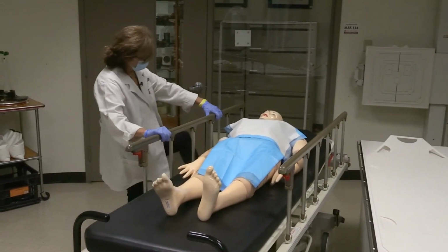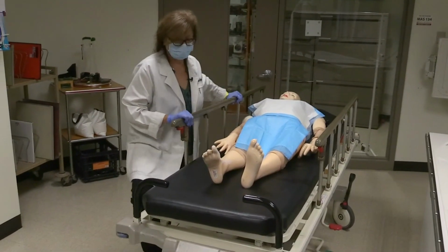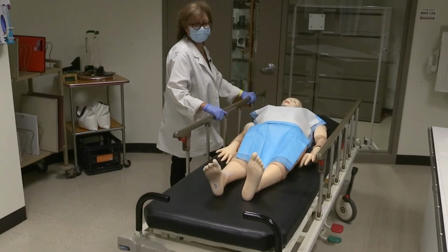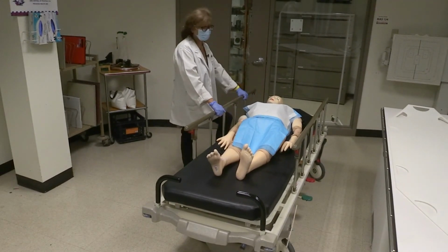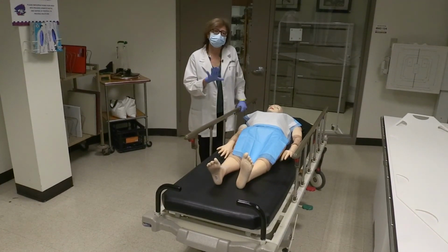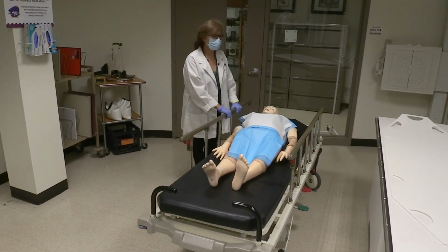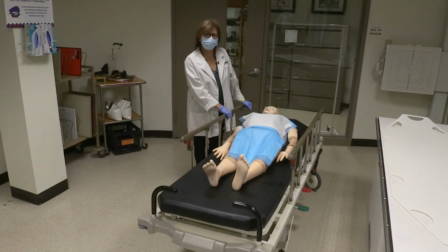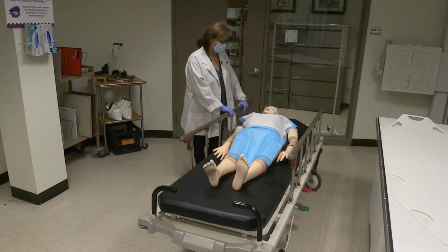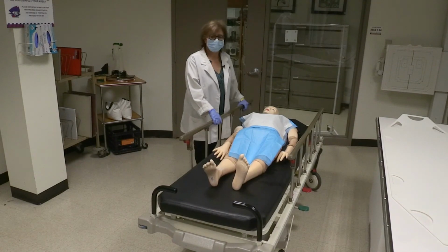I'm going to ensure that they are comfortable. I'm going to make sure my brakes are on, they work, and then I'm going to lower my stretcher to the lowest position. Again, always leave your patient with the side rails up, the brakes on, the lowest position, and make sure they're comfortable and covered. And if they need anything, this is the time to ask before you walk away. And that's it about Body Mechanics 2, Safety and Stretcher.